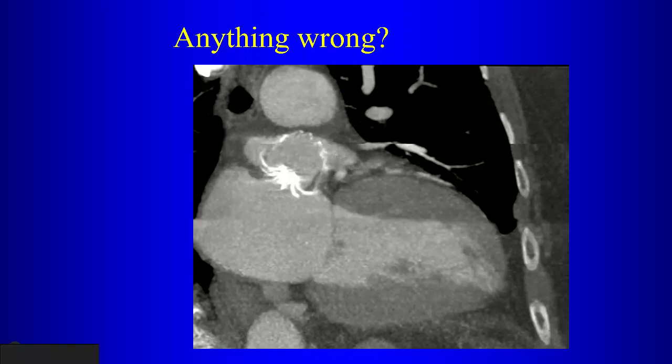Remember, these patients, after they have a Watchman placed, about a month later or so, will have a follow-up CT looking to see if the Watchman is doing what it's supposed to be doing. If we see opacification of the left atrial appendage, what does this mean? Do they have to go back and redo the procedure? Would it fall off over time potentially?